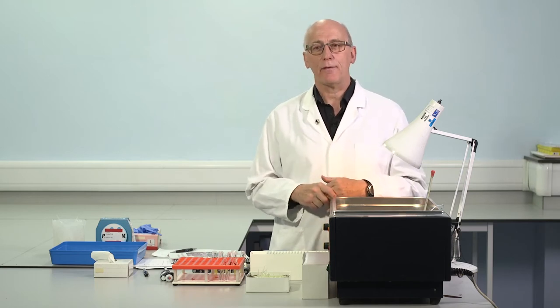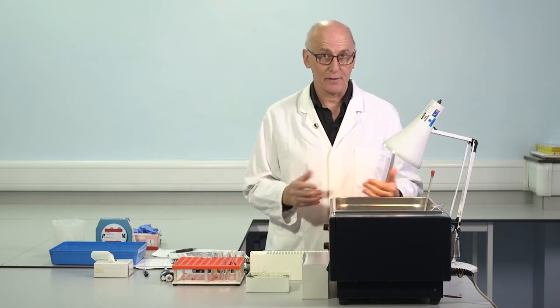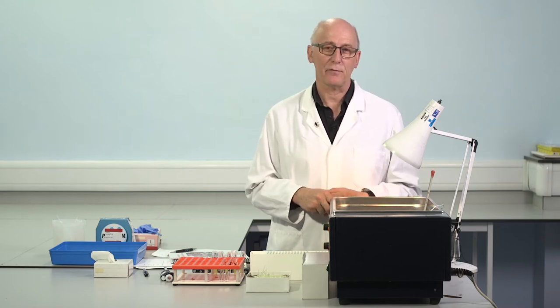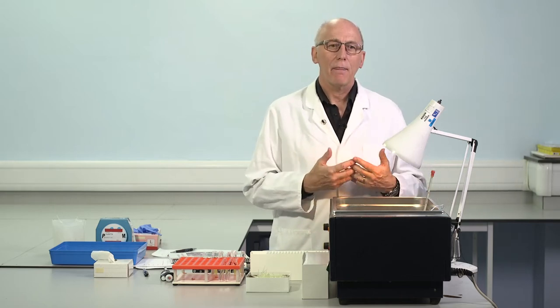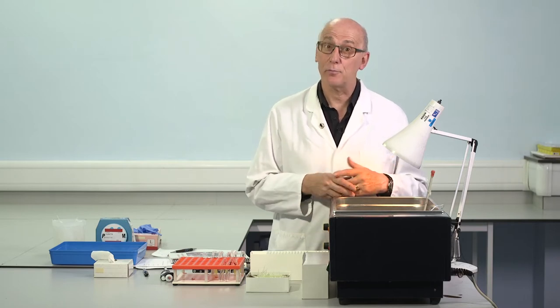When it comes to the water bath, it's important that we use calibrated thermometers. The temperature is crucial. All of the testing we're doing and the thawing is of course influenced by the temperature. We'll be running some manual APTT tests in a moment. And in this case, the water baths that are used should be carefully controlled, and the temperature should be recorded.